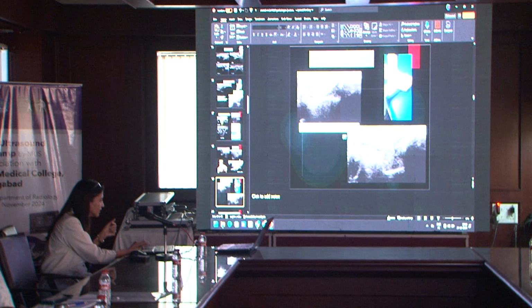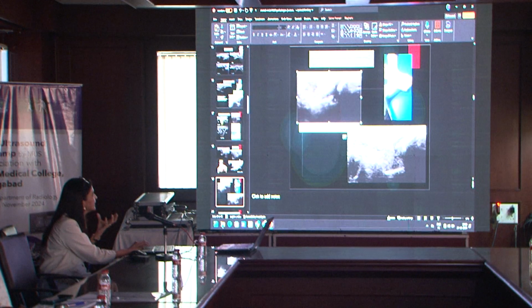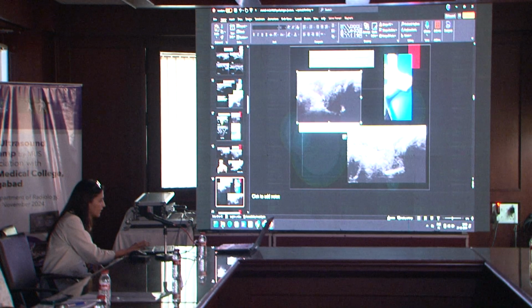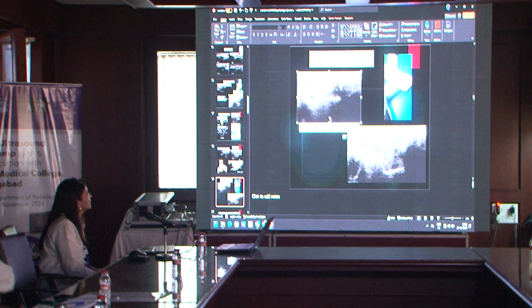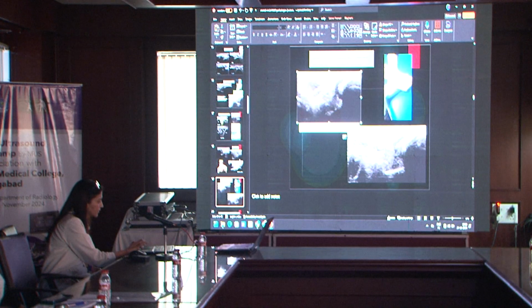Okay, so here this is an example of complete tear of the deltoid ligament. So, this is a dynamic maneuver. It is only during the dynamic maneuver that the complete tear would be visualized well. So, that is our ligament. What we see here is, can you all appreciate here the fluid and the break of the ligament? We will just go in a loop and see that again. Okay, so that is the complete break. So, this is a complete break of the deltoid ligament.